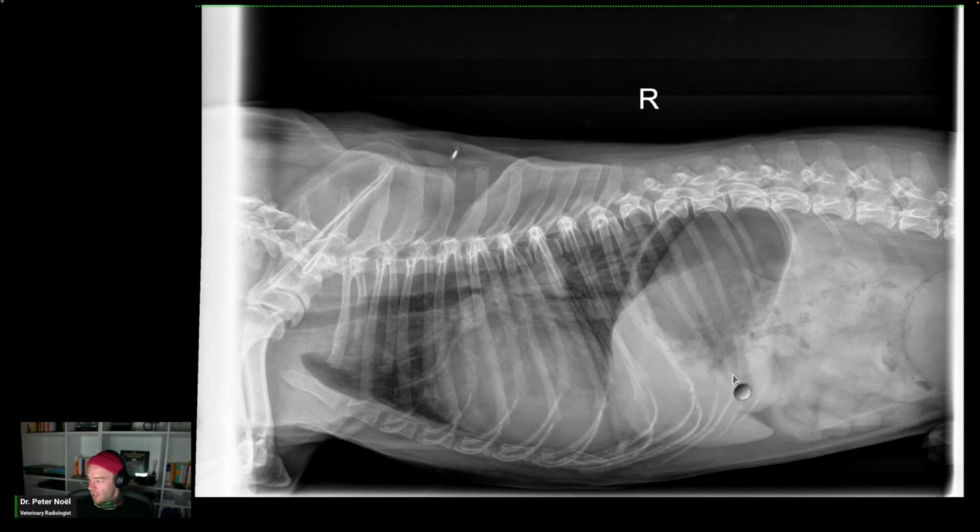But let's just say Dr. Curtin was like, I think this dog has right-sided cardiac disease as well. I think you could describe this as moderate to severe generalized, but predominantly left-sided cardiomegaly. That's what I would say. Moderate to severe generalized, meaning right and left, not globoid. Sometimes I'll say in my report, moderate to severe generalized (right/left) cardiomegaly, but predominantly left-sided cardiomegaly.